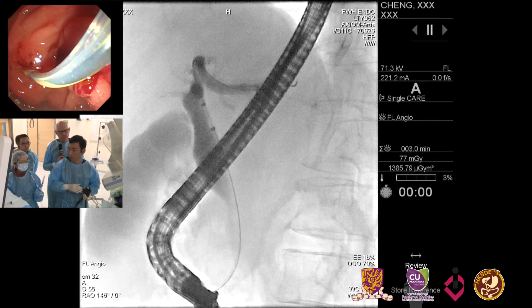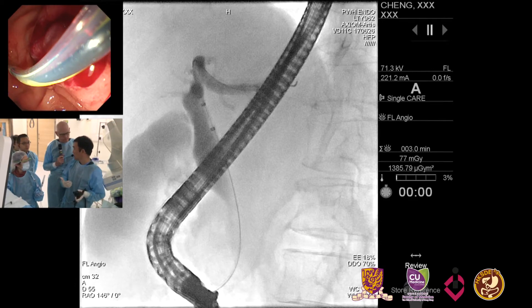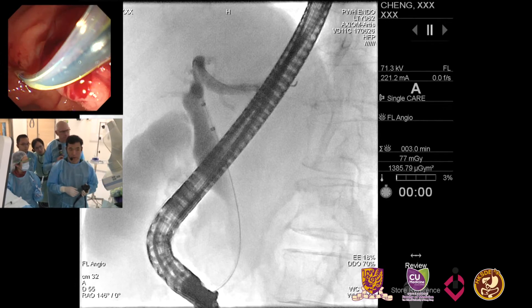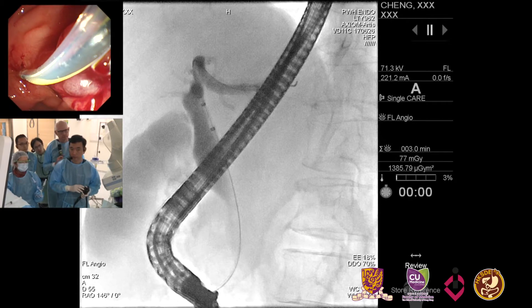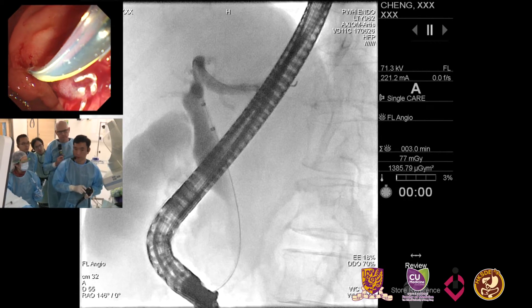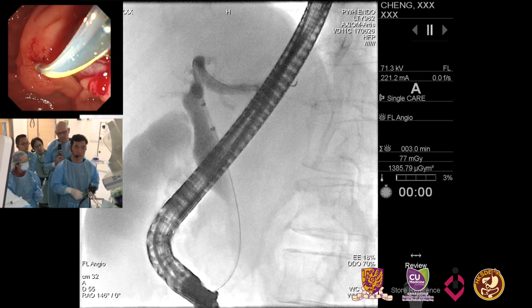So we're not placing a stent. I think it's reasonable not to stent. The panel agrees as well.